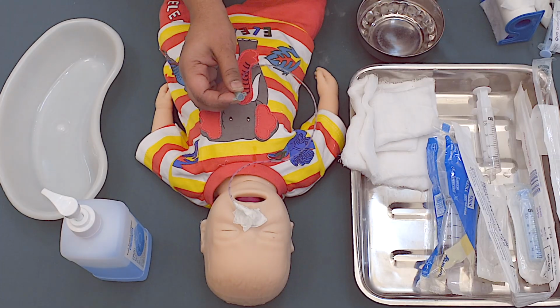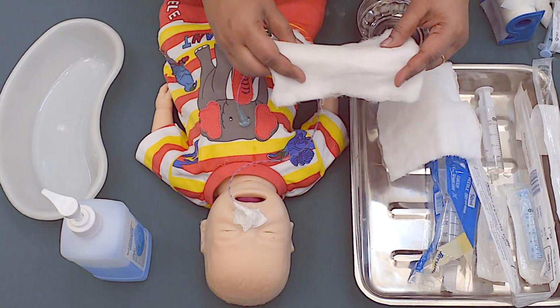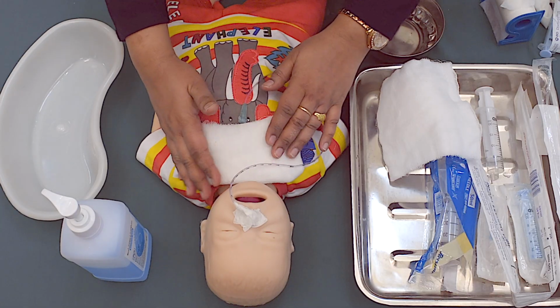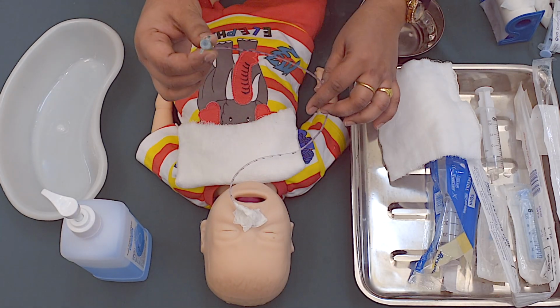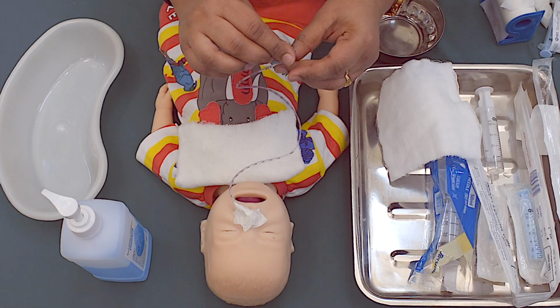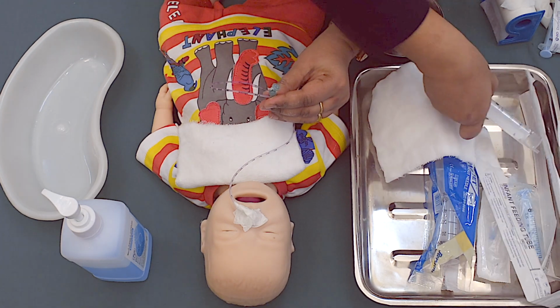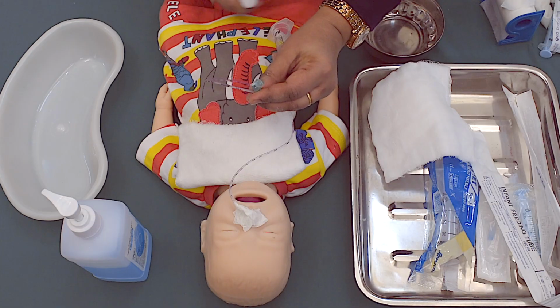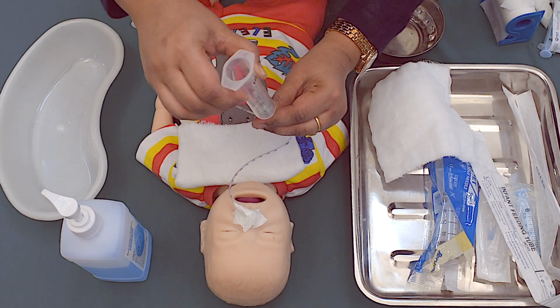After checking the placement of the tube, place a face towel across the chest of the baby to avoid any spillage on the clothes of the child. Clamp the tube first and open it. Attach the barrel of the syringe to the tube.